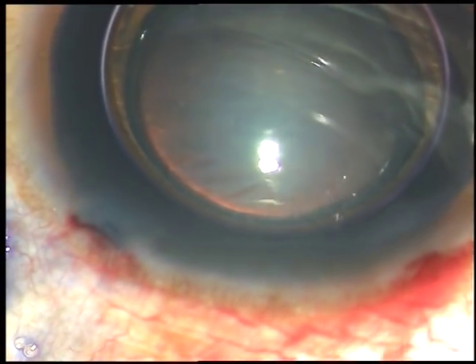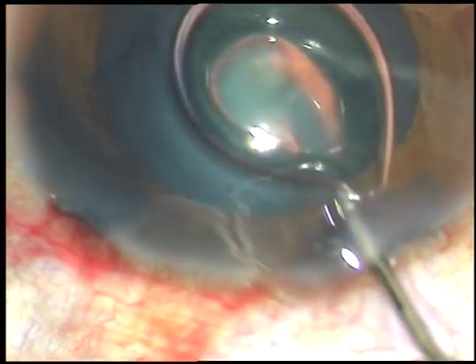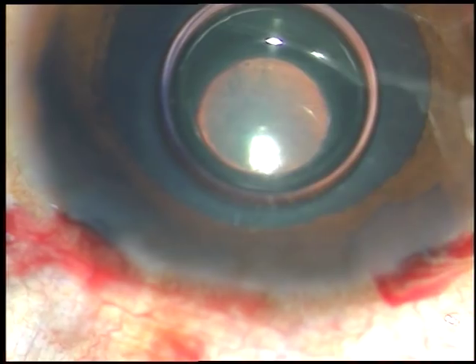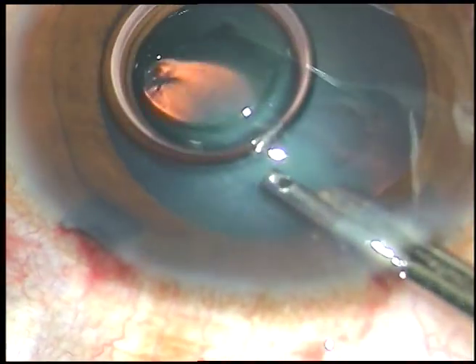Now this is trypan blue dye. It has been used to stain the anterior capsule. A little bit of adrenaline has been used and now the dye is washed out.